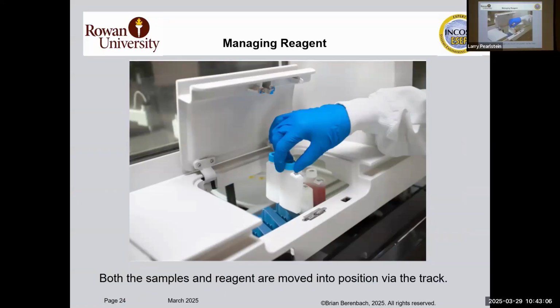Here's loading and unloading. Here's what the track looks like. Analysis station, analysis station, analysis station.